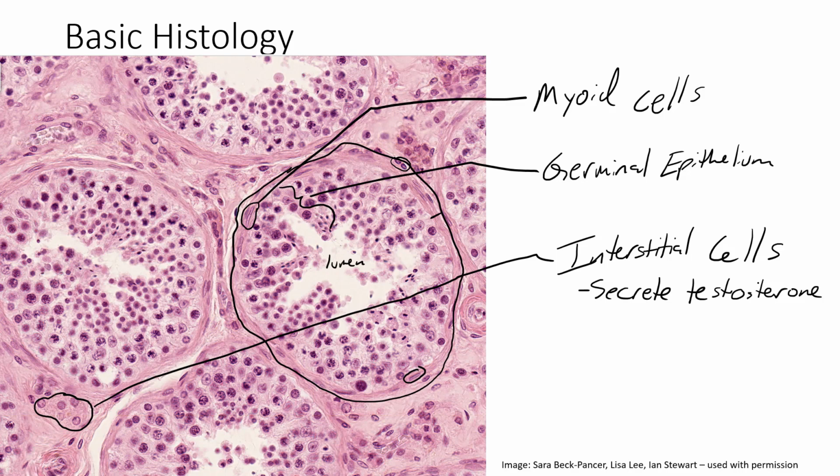And these interstitial cells are stimulated by the hormone called interstitial cell stimulating hormone, or ICSH, which is the exact same molecule as luteinizing hormone in women. So it's going to stimulate these cells. They're going to produce testosterone. These cells are initially active during the fetal stage of life, and it is in fact these cells and the testosterone that they produce that are responsible for the developing fetus taking on the male body plan.